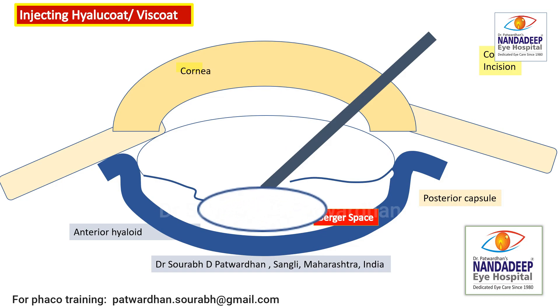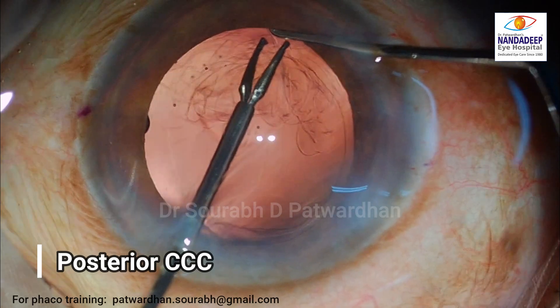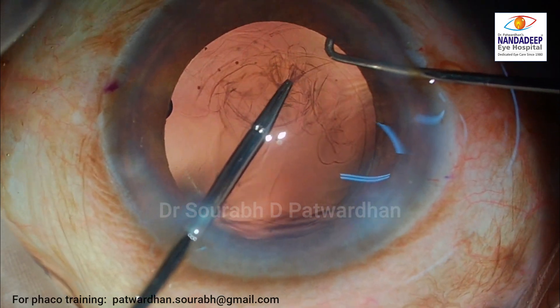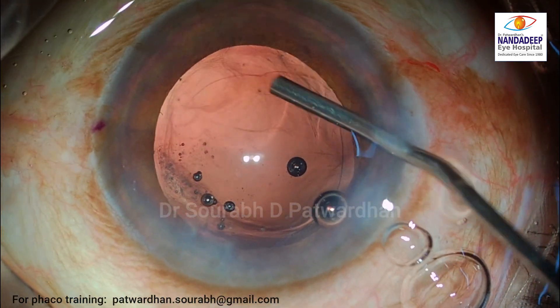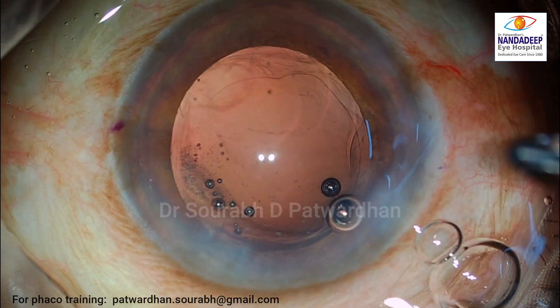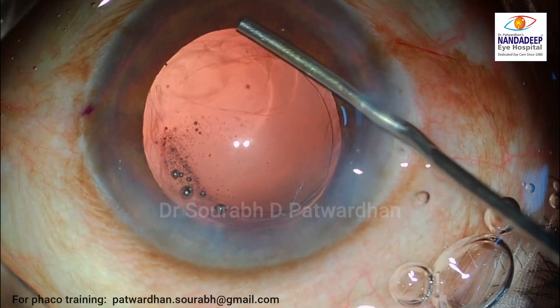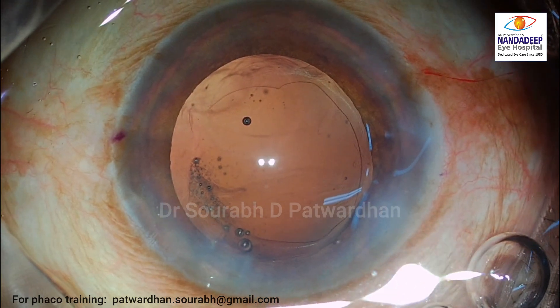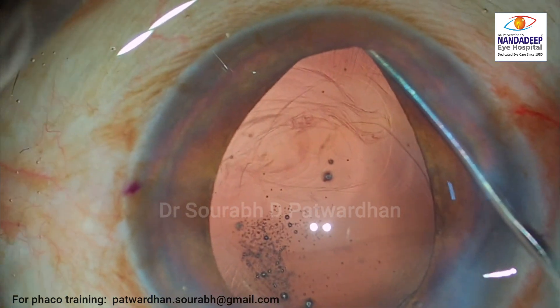Once the anterior hyaloid is made safe using Hylucoat, I am converting this posterior capsular tear into a posterior CCC by catching hold of the tear in the posterior capsule and completing it, similar to how we do the anterior CCC — and it is quite simple. The most important thing is that the anterior chamber should always be well formed when performing the posterior CCC. You can see a nice posterior capsular rhexis with no torn edges, making the posterior capsule quite strong.